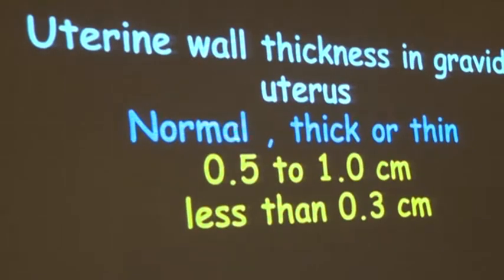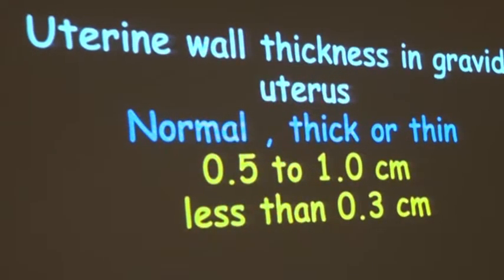Uterine wall thickness in a gravid uterus is an important factor to look for.